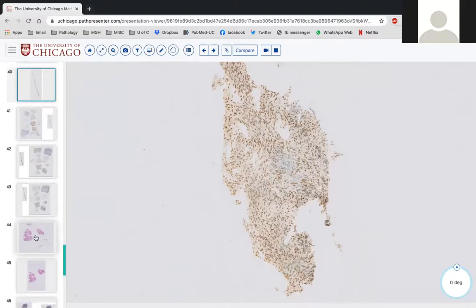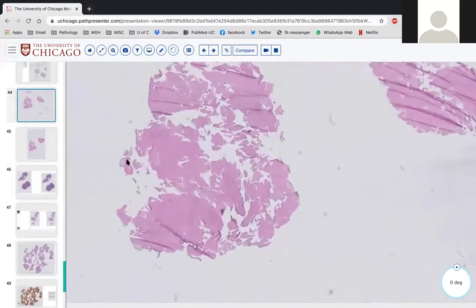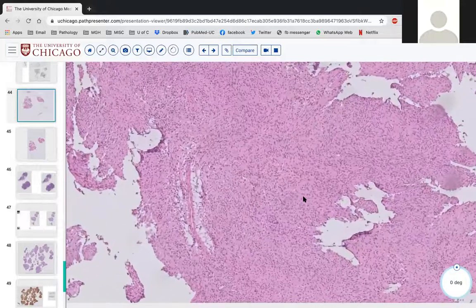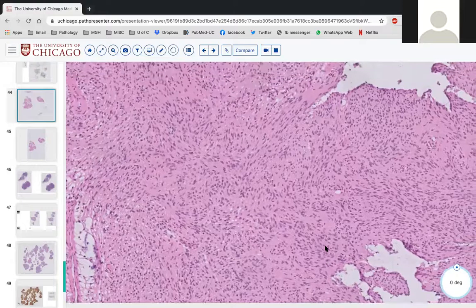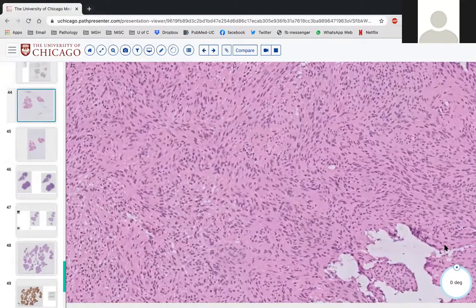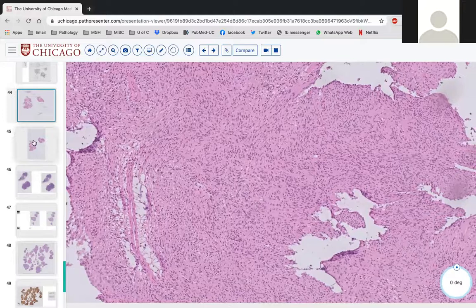So then this patient went to the OR. I believe we probably added a comment like defer to anticipated resection specimen. And so she did go to the OR and some portions of her tumor were frozen. And so here, looks similar or different to the core, Brooke? It looks quite similar. If anything, I'd say the spindle cells now look a bit storiform in architecture, but otherwise the same. Yep, I agree. It's the same.